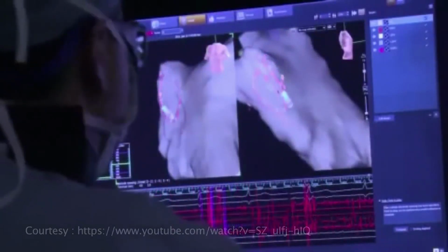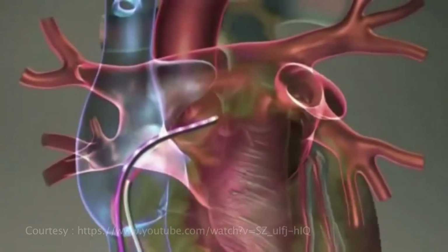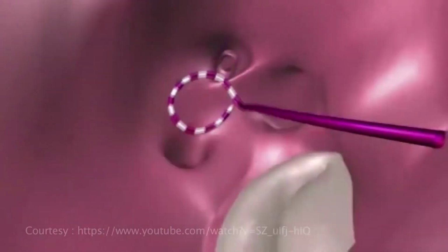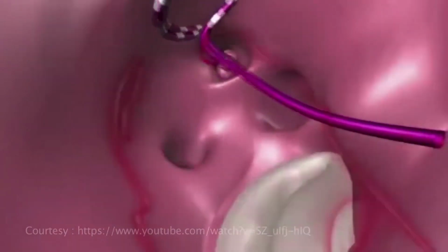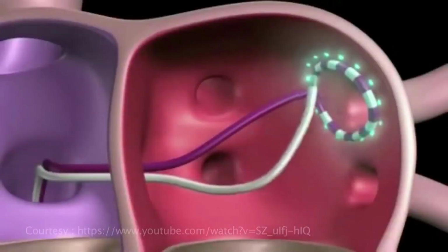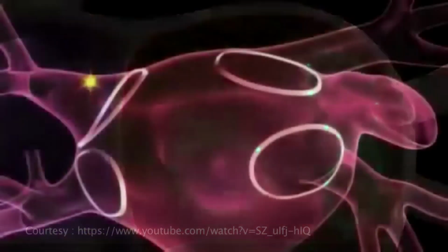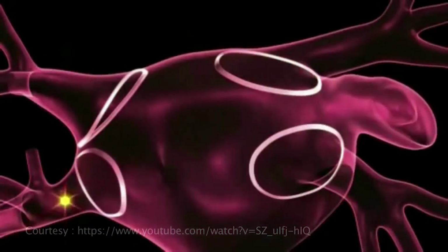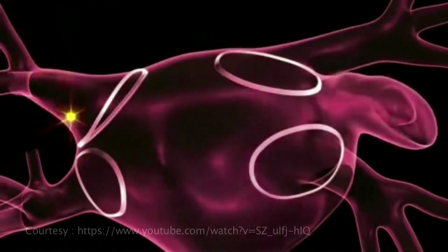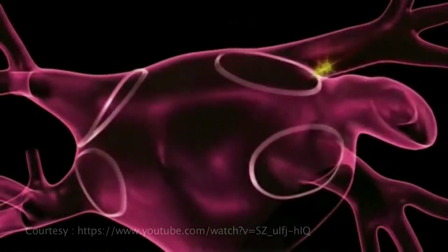As we cross to the left side of the heart, the left atrium, this is where actually most of the action of atrial fibrillation happens, and we use the mapping catheter to see where the electrical activity is and how much electrical activity is around the pulmonary veins, and we use the ablation catheter to cauterize and eliminate this electrical activity and to confirm that we have isolation of the pulmonary veins so that the impulses that come from the pulmonary veins don't make it to the left atrium, and therefore maximizing the chances of keeping the patient in normal rhythm.